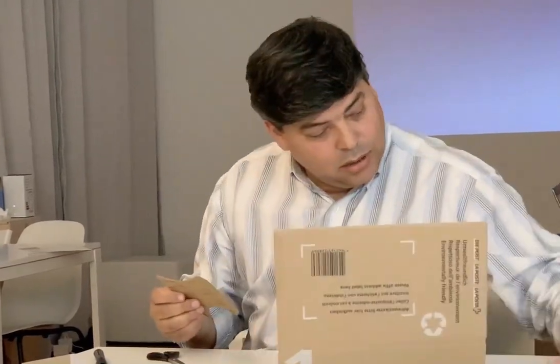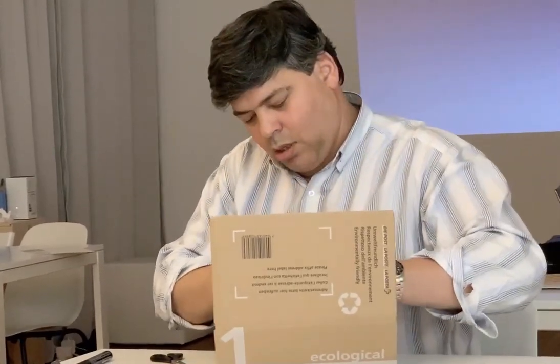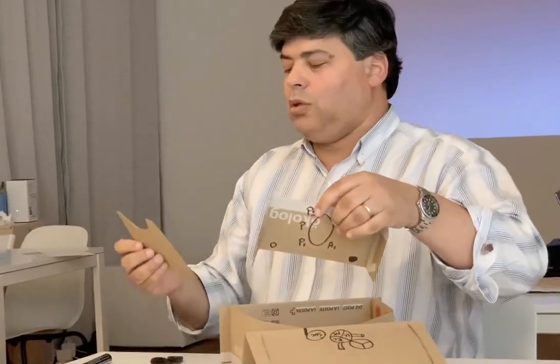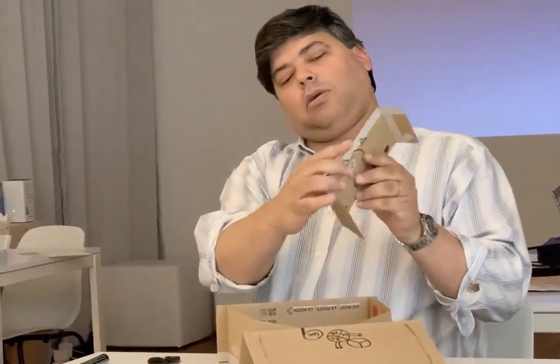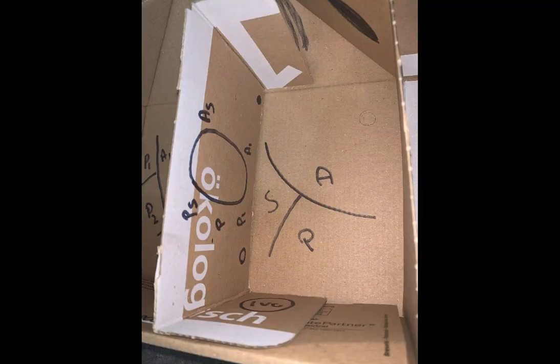This way, this is the septum primum. Now we are ready. It's already done. Septum secundum, septum primum, connect. It's well connected. If it's not connected, it's a PFO. And it's all the septum here. We take it in there. And here we have the complete box. Okay?